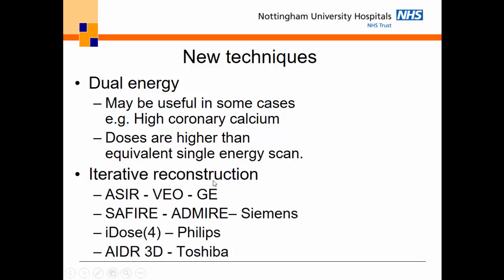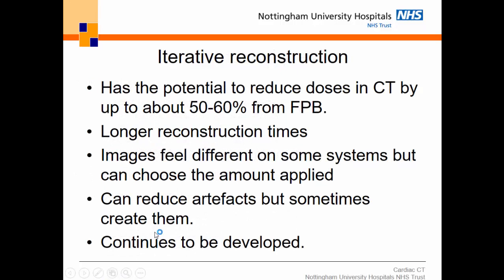Sue mentioned iterative reconstruction. They're all bringing out different software versions of this really, but essentially the more money you pay, the better the image quality or the lower the dose that you'll get. So it has huge potential for reduced doses. The images feel a little bit different if any of you have seen it.